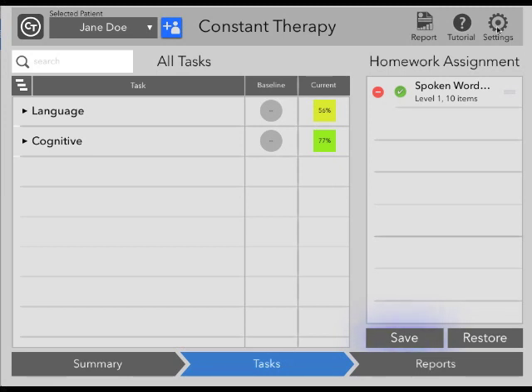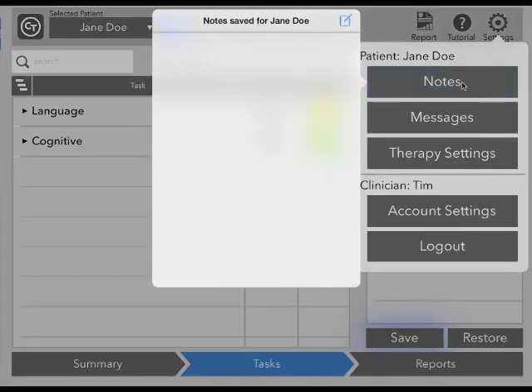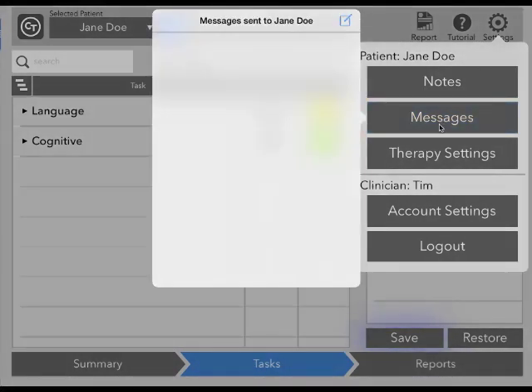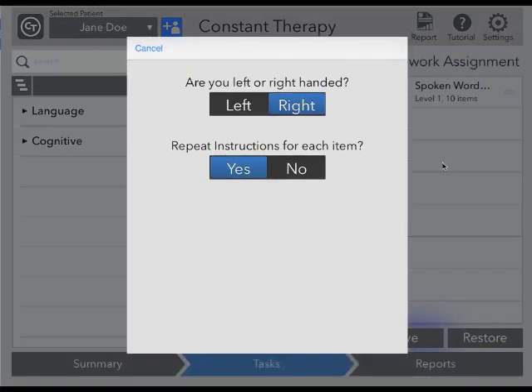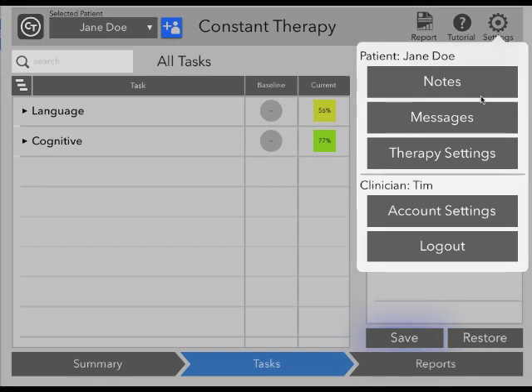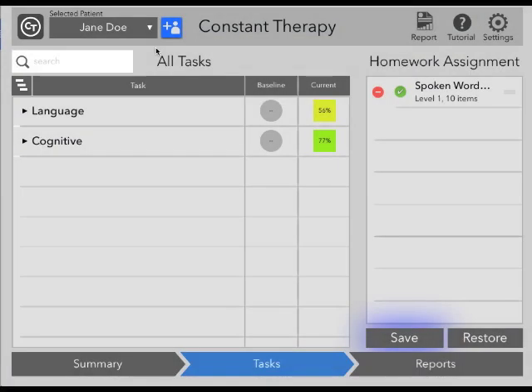In the top right-hand corner, you'll also see a settings icon. Within settings, you have a number of options. You can take notes, and these notes are available privately only to you. You can also send messages to your patient — we could communicate with Jane Doe, and she would read this message the next time that she opens the app. You can also adjust therapy settings; for instance, we could specify that Jane Doe is right-handed and that she would like to repeat instructions for each item she hears in Constant Therapy. Also in settings, we have the account settings section. In account settings, you can adjust your contact information or change the password to your account.